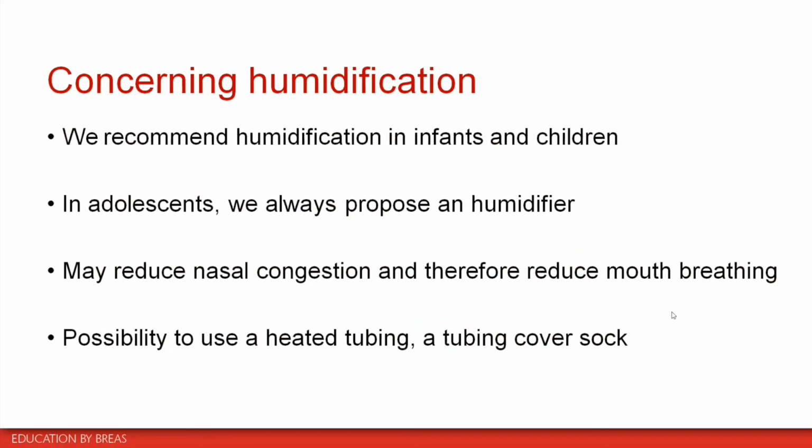What we can see sometimes in infants is that if the humidification is not enough, they will have kind of flu symptoms, with the eyes a little bit red or bright, and the nose that seems to be a little bit obstructed. And by increasing humidification, if these symptoms are removed, that means that it was a problem of humidification.